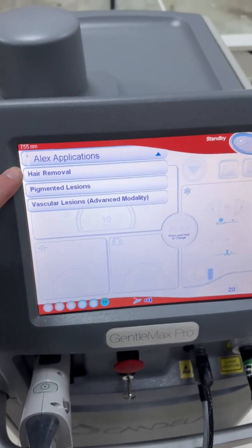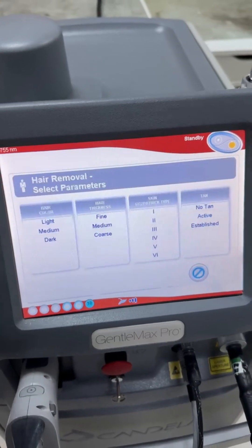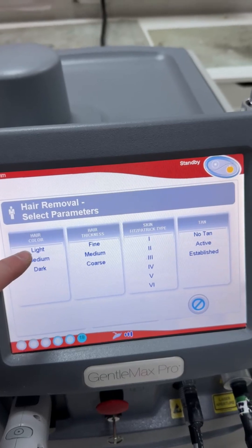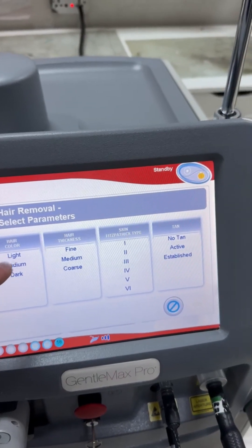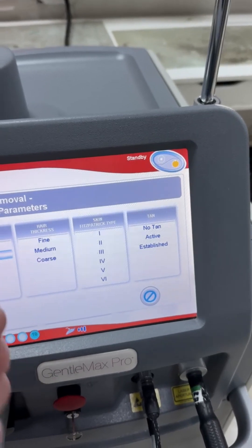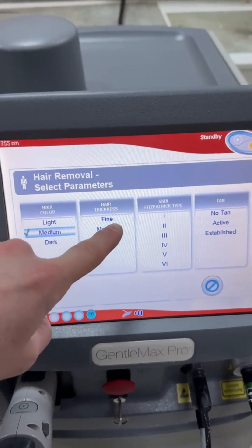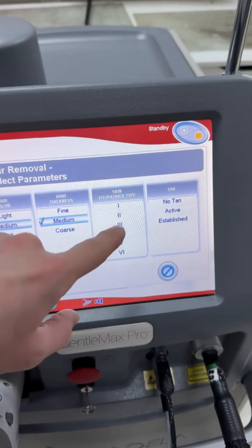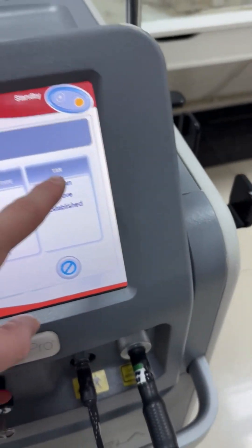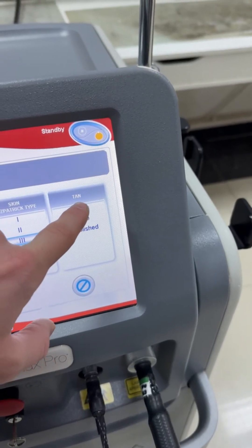If you don't know which parameters you should use, you can go to this menu. First, you need to choose which hair color you are dealing with — is it dark or light. Then select the level of hair thickness, then the skin tone level, and finally choose whether there is a tan or not.